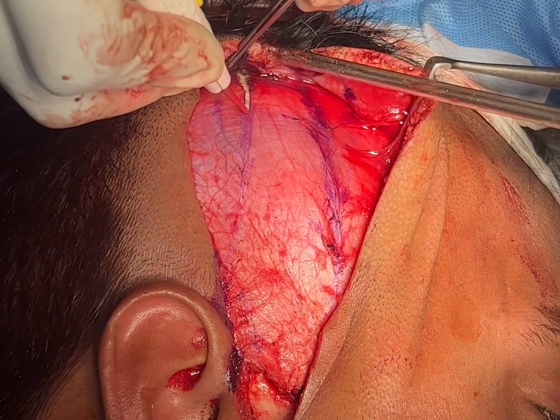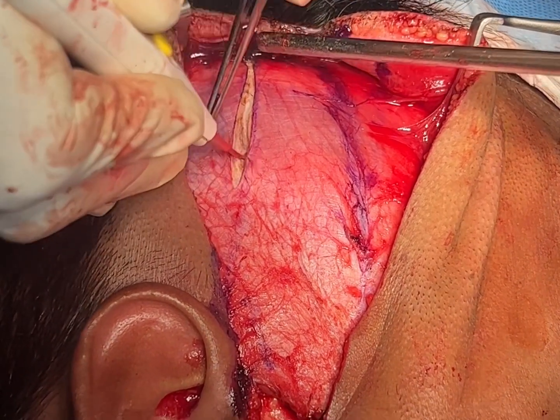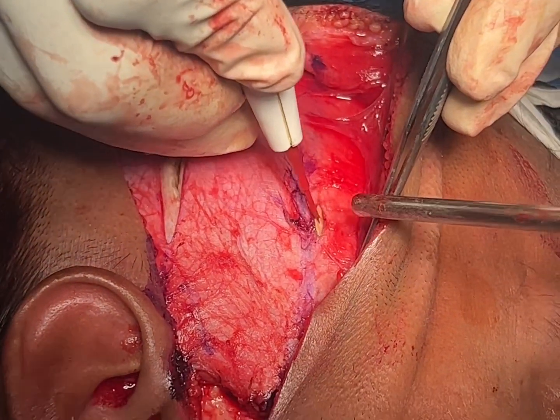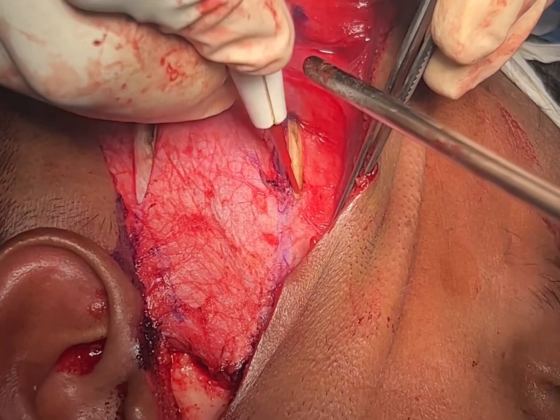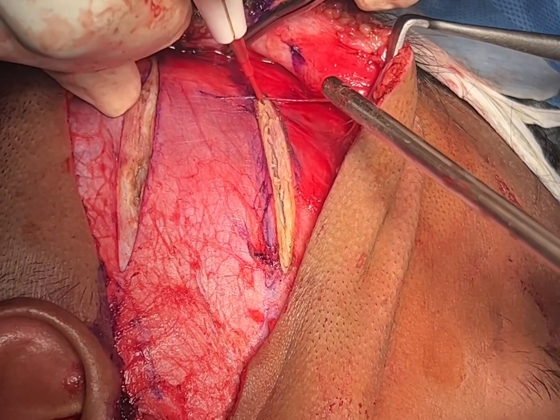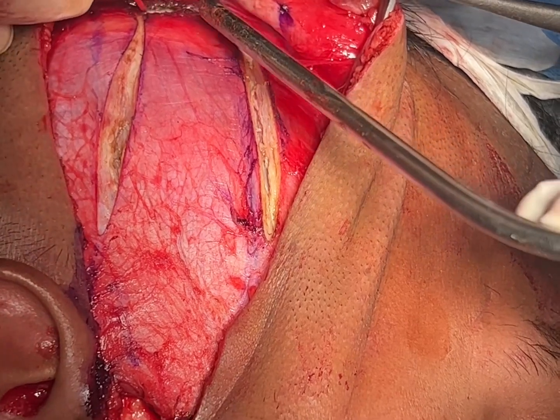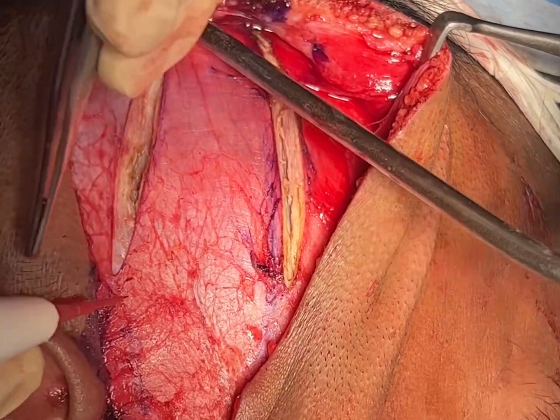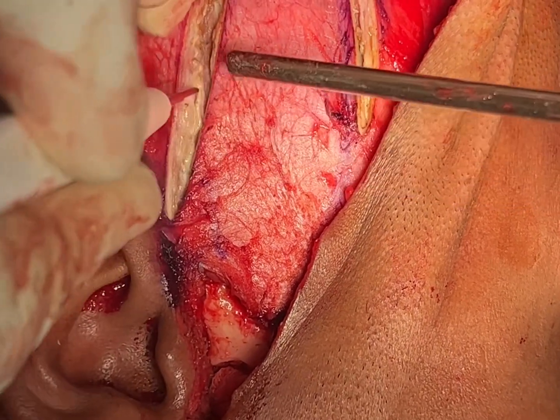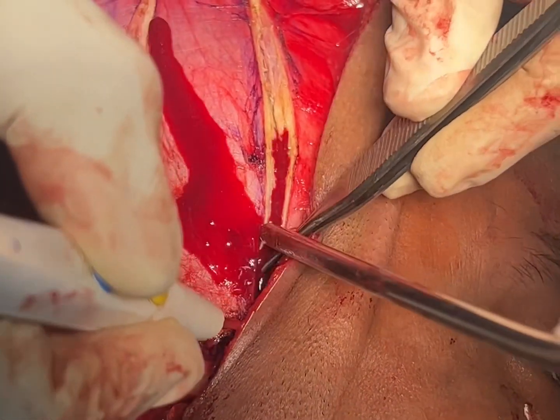We're raising a temporalis muscle here — you can see me making the incision. We're doing this as part of the reconstruction post temporomandibular ankylosis release. This muscle and temporoparietal fascial flap that you see being raised is going to be used as part of the pseudo joint — the joint we're creating that's going to allow the patient to use the jaw.